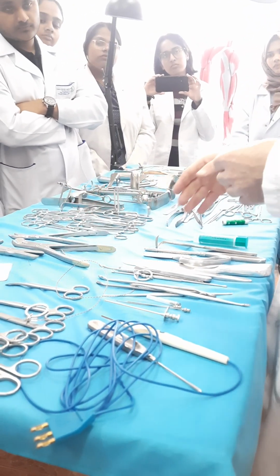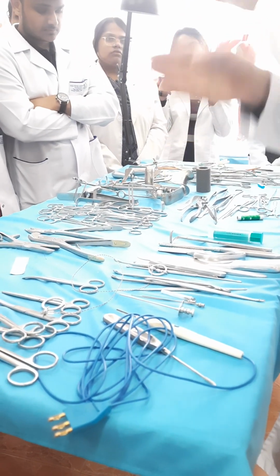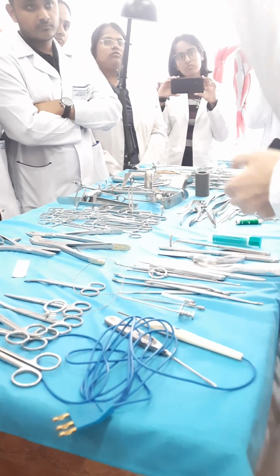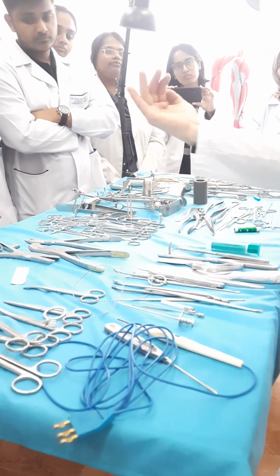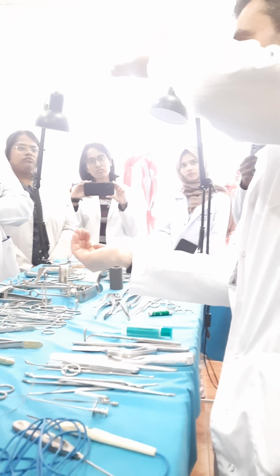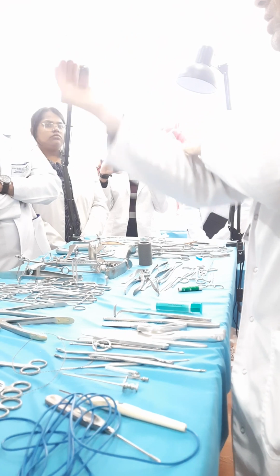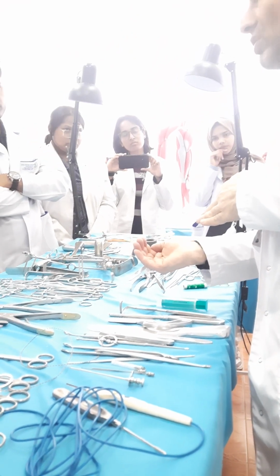There is one more forceps, which we call Dahlgren forceps. Dahlgren forceps work like the bone scissors. It is passed from down to up and cuts. You insert the bone between the upper unmovable and lower movable branches of it. Then you press the handle, the lower branch goes upwards and cuts the bone tissue which is between.